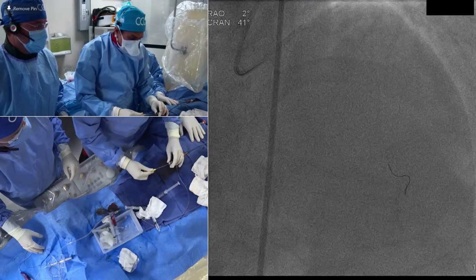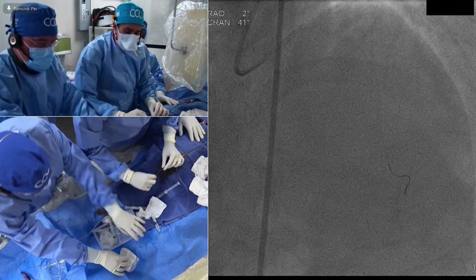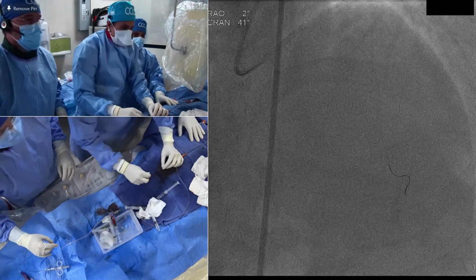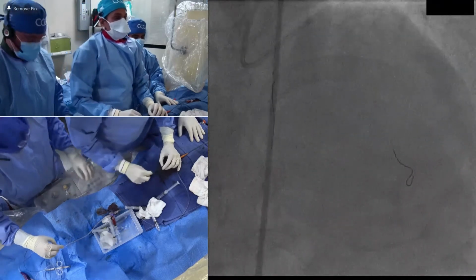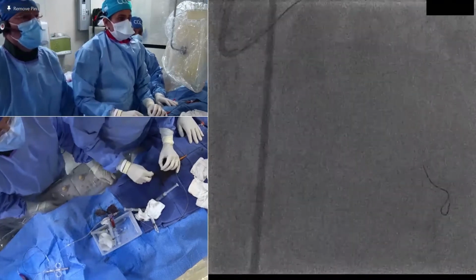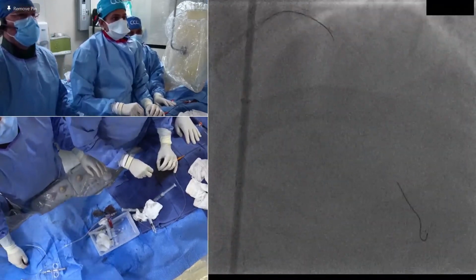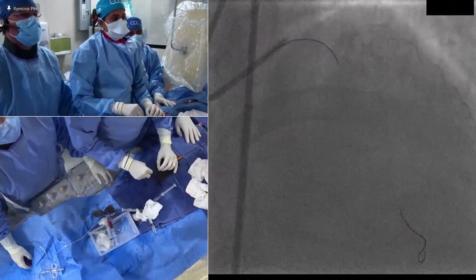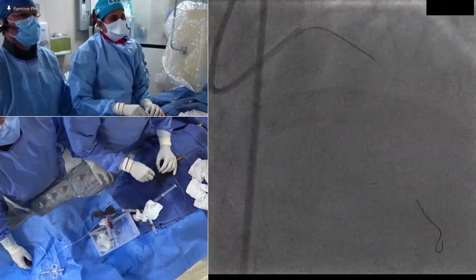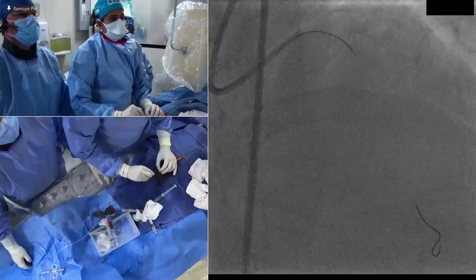Very important that yes, diabetic 3-vessel, but this guy had spot lesions, and during the discussion, the patient wanted a PCI. So that's why in the first sitting, the OM and the RCA were taken care of. But a very important point is that the heart team discussion has to be outside the room with the surgeon and cardiologist there. Then only it is validated, because on the table, the threshold for going for intervention is very high. So it has to be outside, and that was done in this particular case.